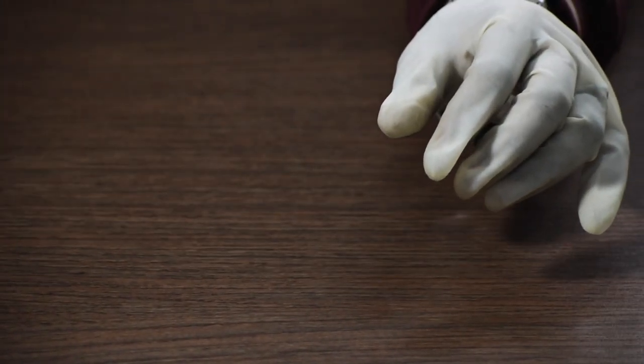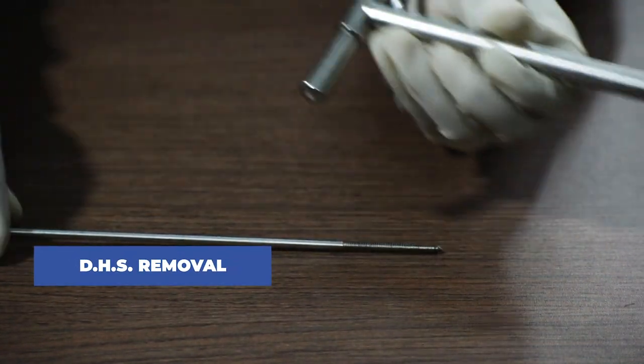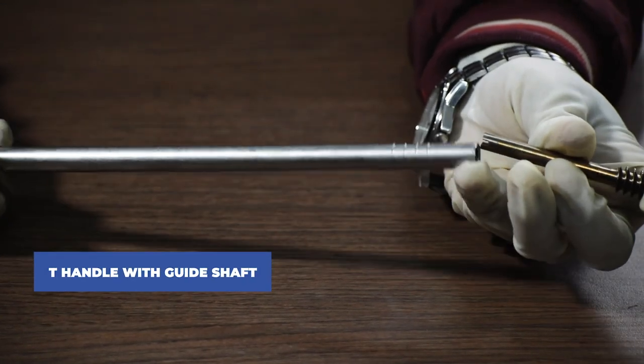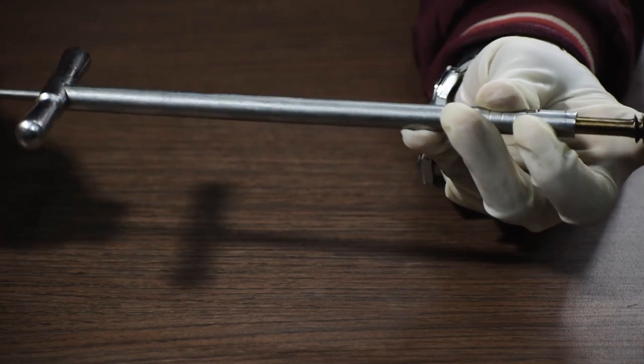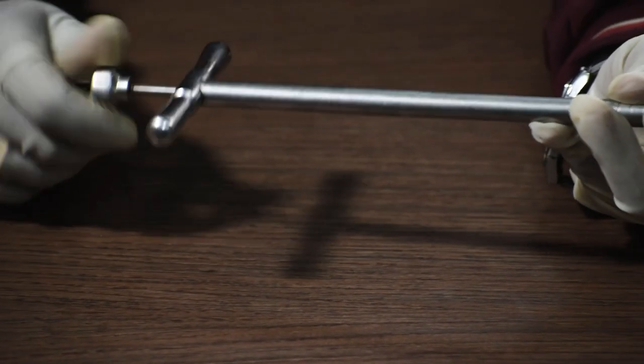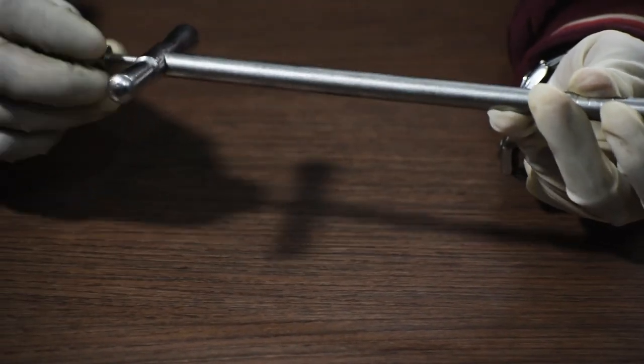Now, that was a part for the plate fixation. Now coming to the DHS plate removal, in case there are complications in the patient, we are going to use a T-handle with guide shaft to lock the lag screw and preventing it from further movement. Once locked, the removal procedure starts.